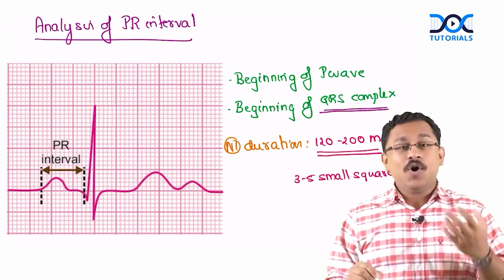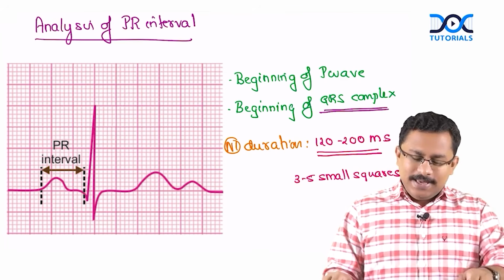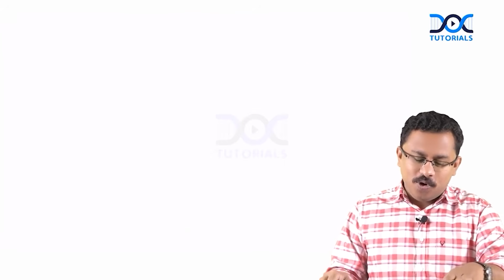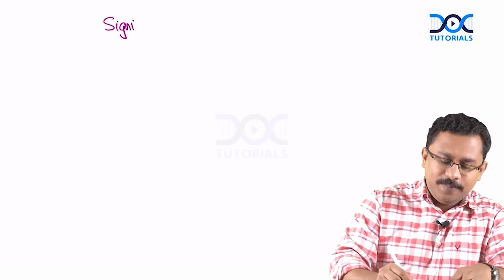So that is the normal duration of the PR interval. Having seen what the PR interval is, let us now move on to the significance of the PR interval.